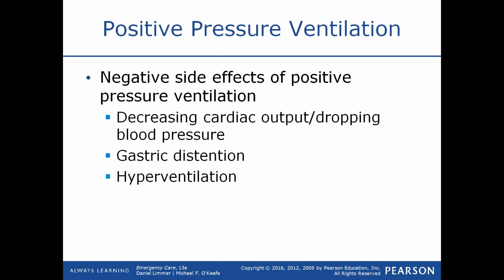If I squeeze too fast with too much force, you have a tendency to dilate the esophagus, and the air then goes down into the stomach as well as into the lungs, and then over time you have this big balloon in your stomach. Your stomach is completely full of air, which may precipitate vomiting. It also makes ventilation more difficult because the diaphragm can't flatten with that big air bubble in the stomach.